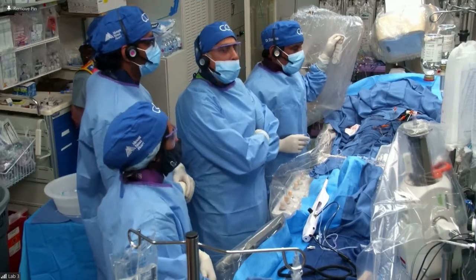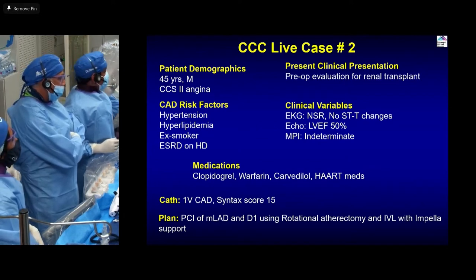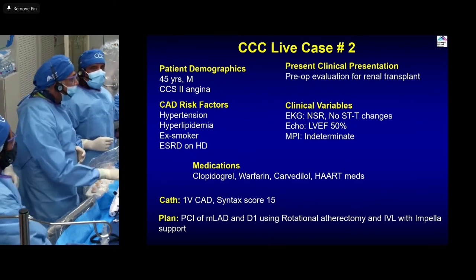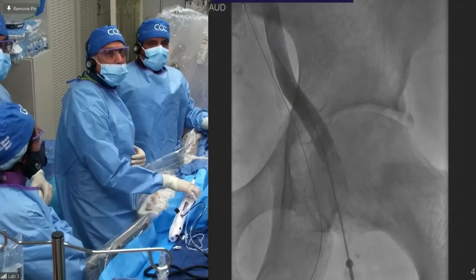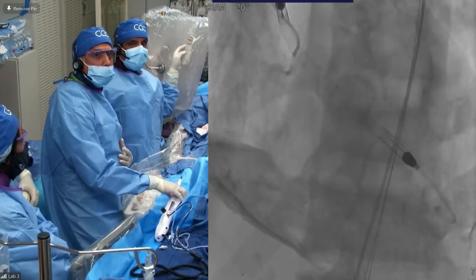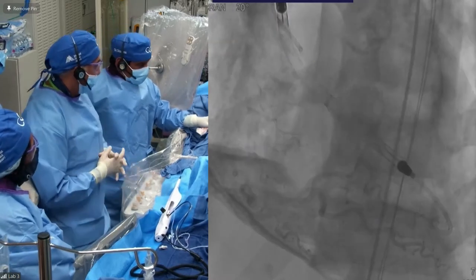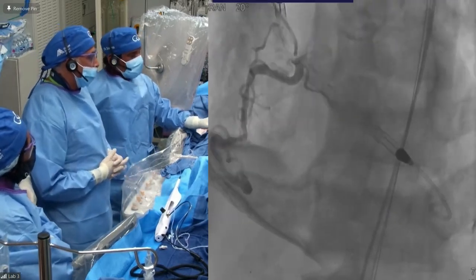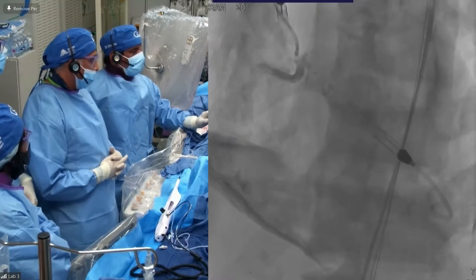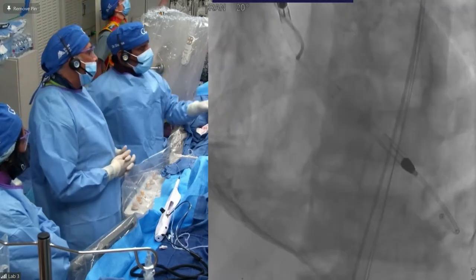Let's start with case number two - they can show the slide. It's a 45-year-old patient with end-stage renal disease, very bad, constrictive, seems to be. You see the pericardial constriction in the bottom? The whole question was patient presented with a pre-op evaluation as class two angina before the renal transplant, EF about 50%, and MPI was indeterminate. So angiogram was done a few weeks ago. You see the calcium in the pericardium.